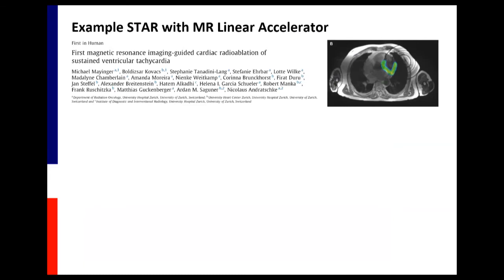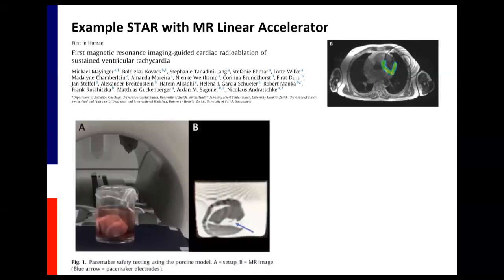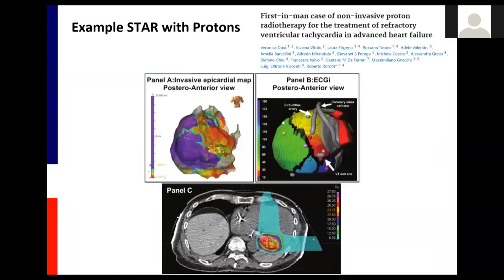And then we have MR Linac. This has been published from the Zurich group. They also treated on an MR Linac. They did extensive testing at the beginning. I'm not really happy to have patients with pacemakers, and this case was actually with a pacemaker that was not allowed, was not MR usable. So they really treated this patient with the ICD off. We generally treat with the ICD on during treatment. So that's very tricky. And they did not treat the heart, but a substructure here. Very ambitious, but a successful treatment. Very nice that they did it.